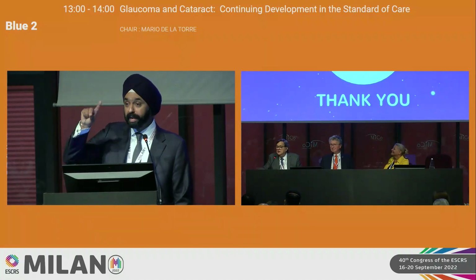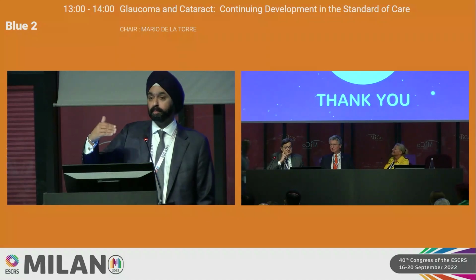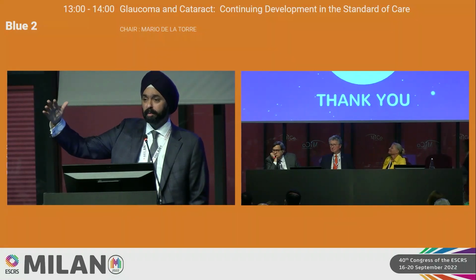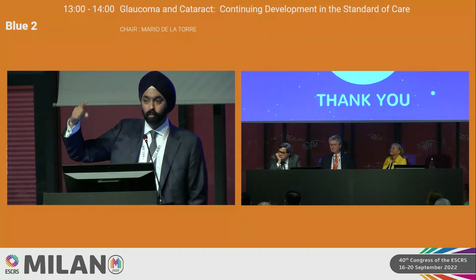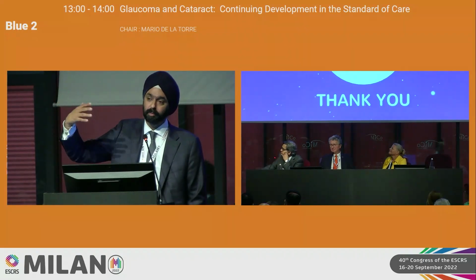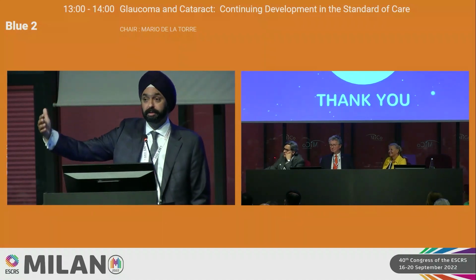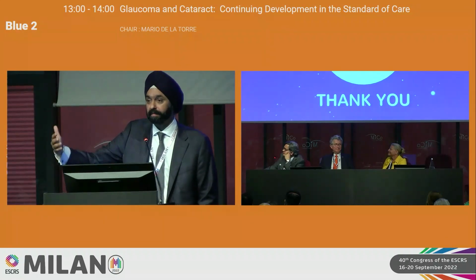So I do one 360-degree session, and that is my litmus test. If it does work well, and let's say it starts to climb up even at 3 or 4 months, 6 months, I will repeat it. If after one session of 360 it did not do much, I don't repeat it again. That's probably a patient who maybe has resistance beyond the TM. But I'll do a second or third session over time if it did have an effect initially.